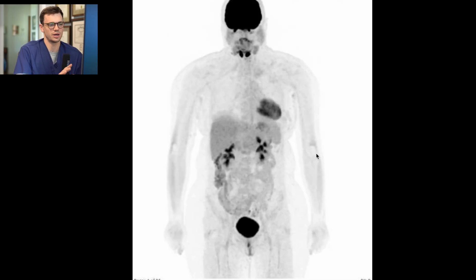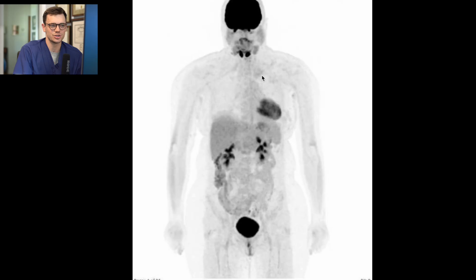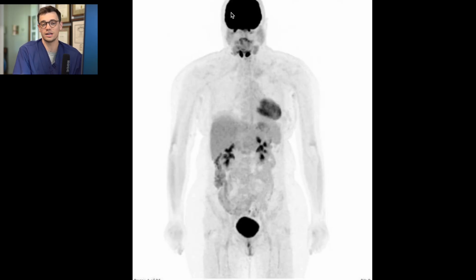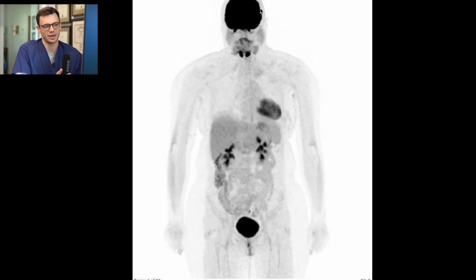What I have pulled up here is what we call the MIP image. I like to look at this as the roadmap of the study — it shows the distribution of the tracer throughout the body. The entire body shows up on this MIP image, at least everything we've imaged, and we can get an idea right off the bat if there's anything abnormal. This is a normal MIP image. The brain is very hot because it's very metabolically active and uses up a lot of glucose. The brain is always going to be hot on an F18 FDG PET scan.